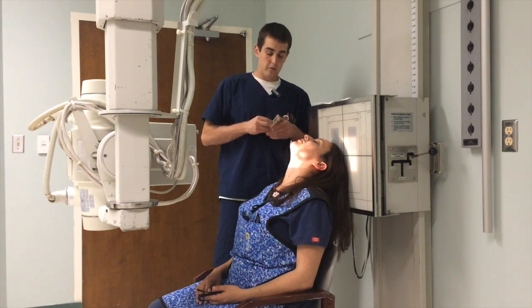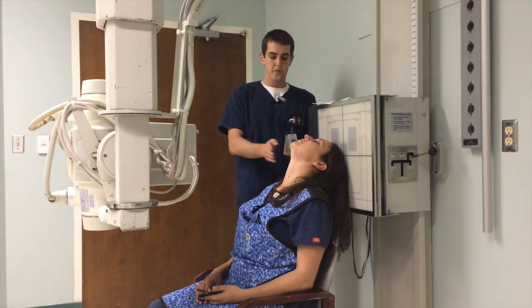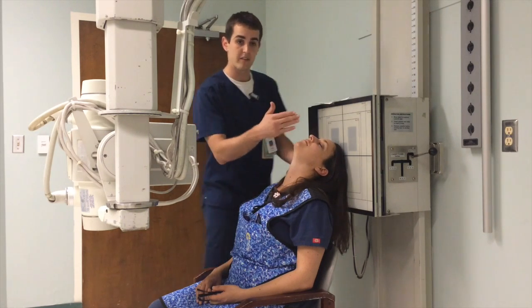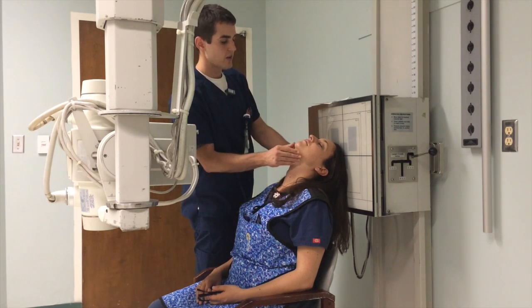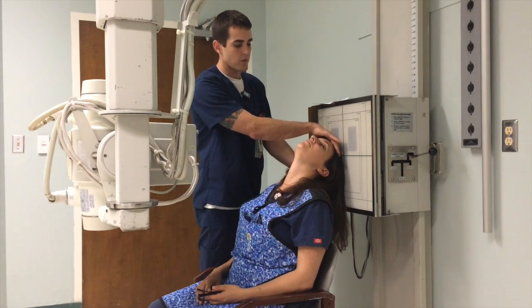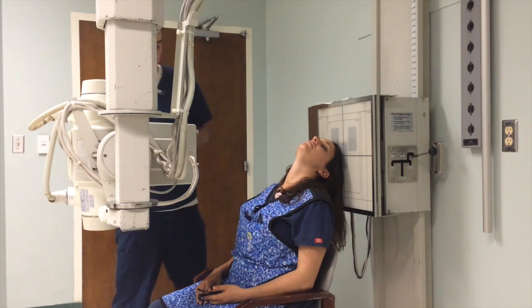So as a unilateral projection, we still want the OML parallel with the IR. We are going to rotate the patient's head 15 degrees towards the side of interest, which she said was her left side that hurt. So we'll rotate her 15, and then we're going to move the top of the head 15 away in order to isolate the zygomatic arch and get it free of superimposition.